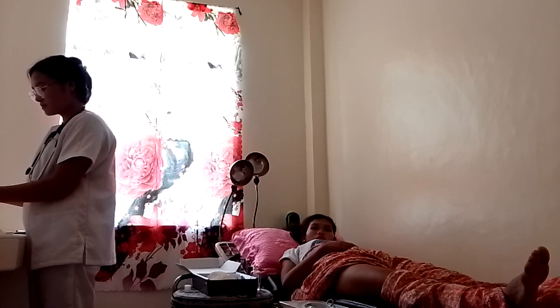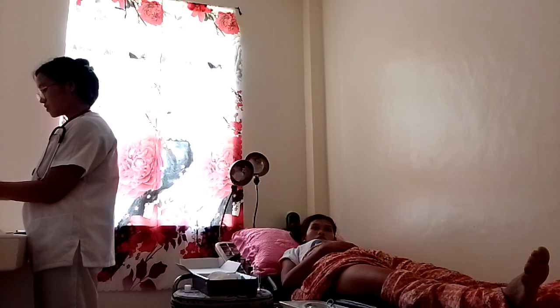Okay, suot lang nato siya. Mag-wear og gloves sa pagbuhat sa ingon ani. Okay, we also need to follow the gloving technique.